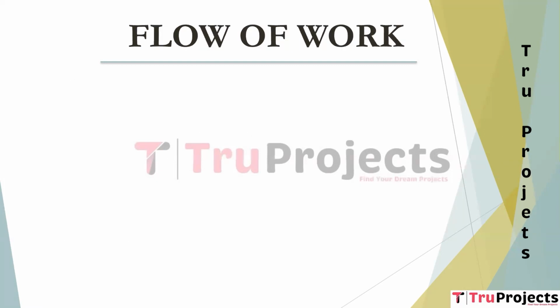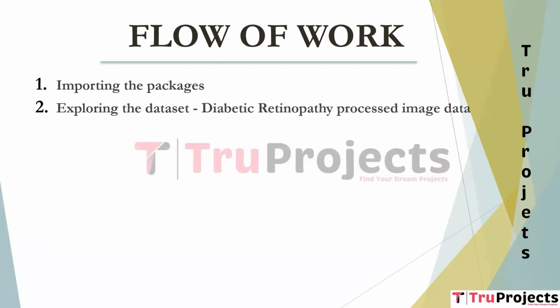We have designed a few modules in the flow of work to implement the project. The first one is importing the packages. This module involves importing the necessary libraries and packages. NumPy is imported for numerical operations, Pandas for data manipulation, TensorFlow for deep learning, Matplotlib and Seaborn for visualizations, and Scikit-learn for machine learning.